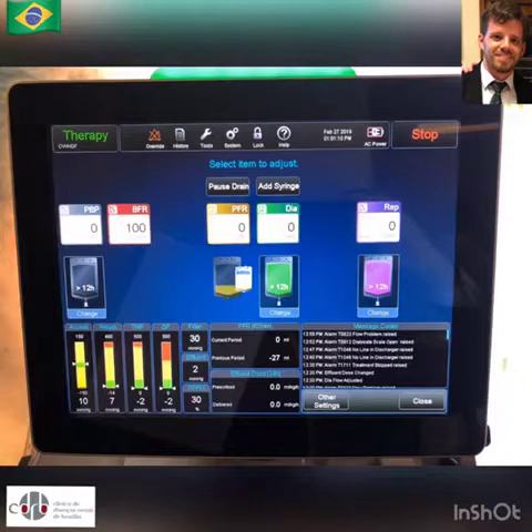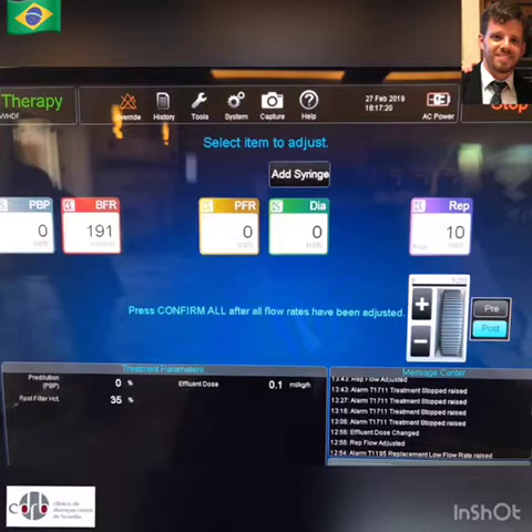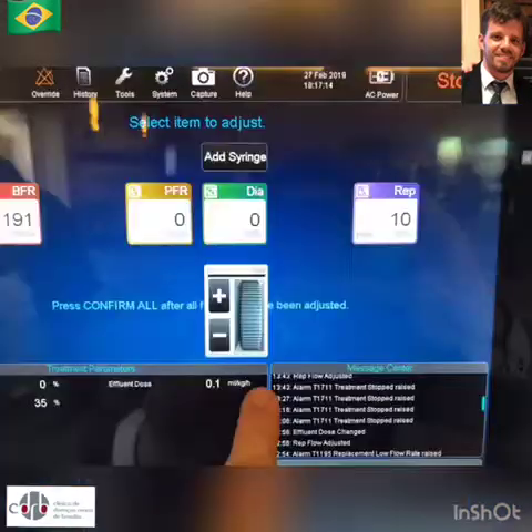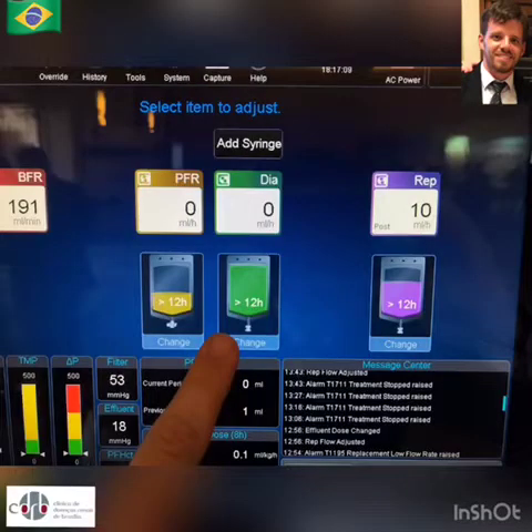The treatment screen features the time remaining for changing bags, all parameters for your pumps, and an additional parameter which is the rate of your waste effluent bag drainage. You are also able to take print screens.